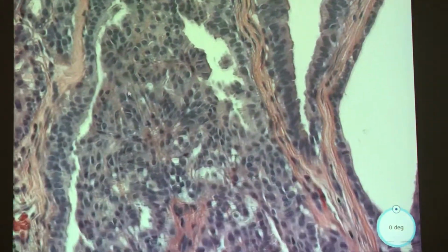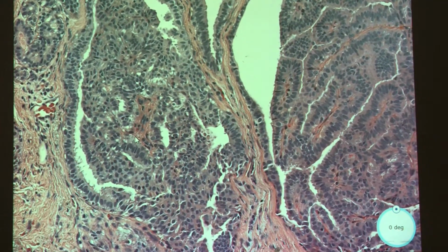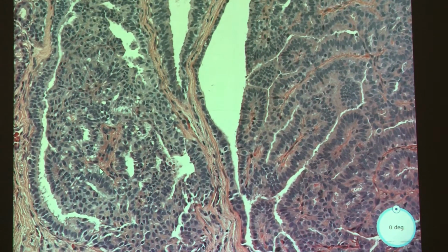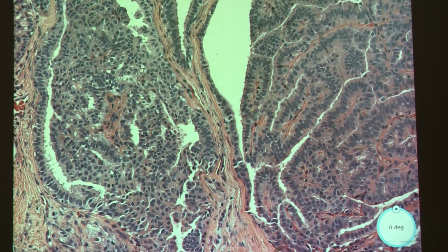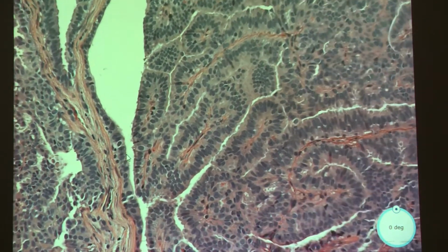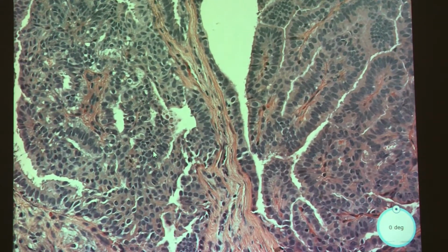So when we have the slits, well, the slits are UDH. Perfect. So this is a little bit of epithelial hyperplasia, but the staining's a little funny. You can kind of tell on this view, more on the right side, the eosinophilia is a little more prominent. So I think you actually maybe have a little bit of apocrine change.